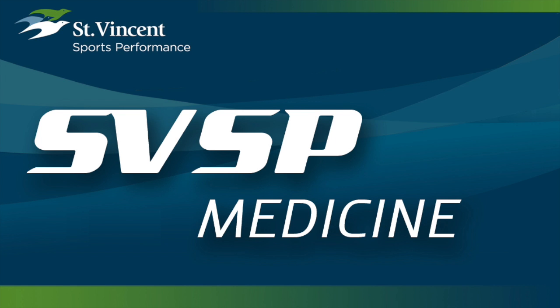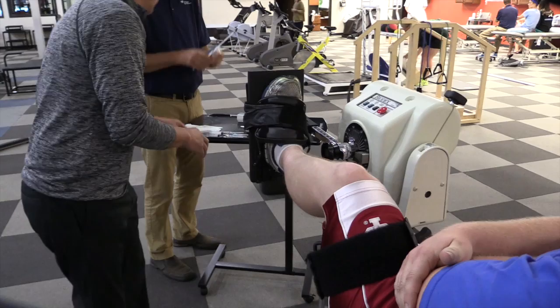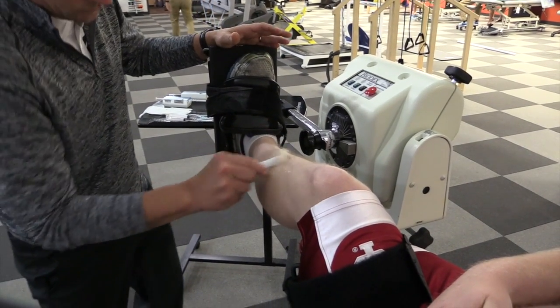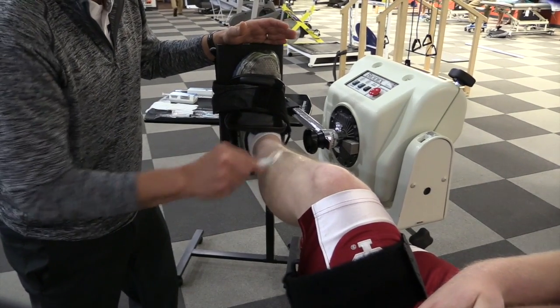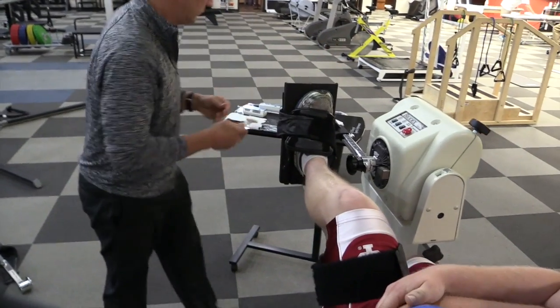This is an instructional video on the process during exertional compartment pressure testing at St. Vincent Sports Performance. The appropriate area is marked identifying the anterior and lateral compartments, and these areas will be appropriately prepared including a chloroprep cleaning of the area.